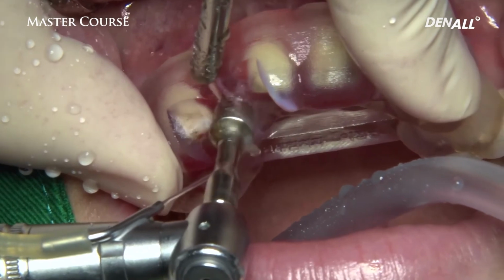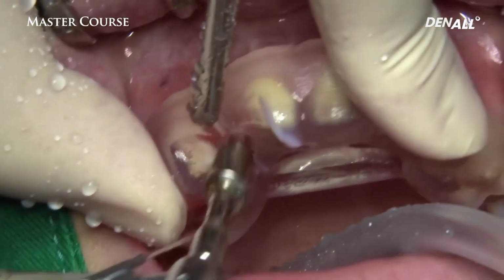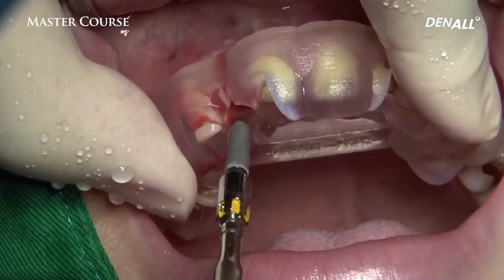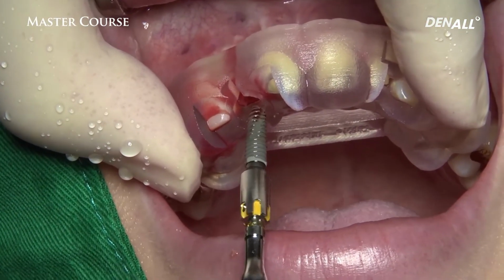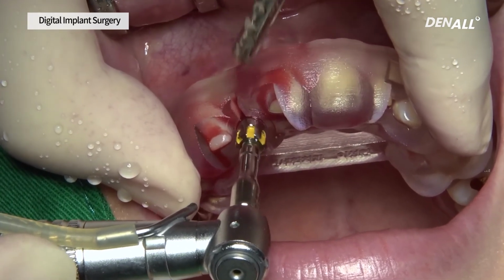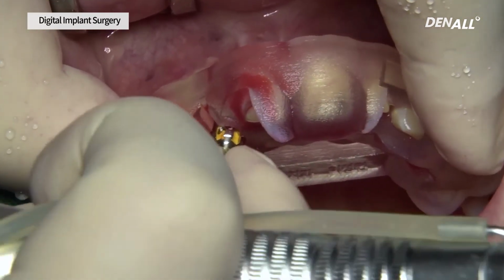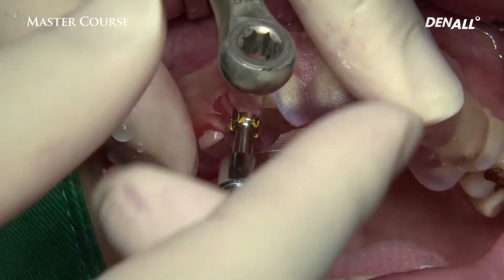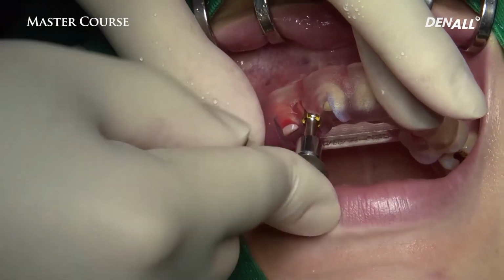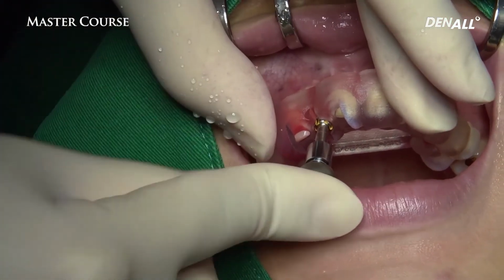First, the bone flattening drill is used to flatten the surface of the bone where drilling needs to be done. A tapered drill is used to expand the hole sequentially. After checking that the implant is sufficiently wet, the implant is placed. Here, the whole guided template is in line with the yellow line of the driver. Even the implant's hex position is properly placed as planned.